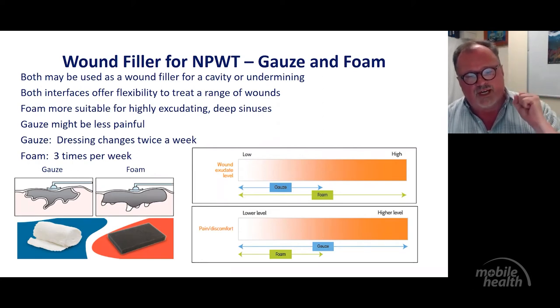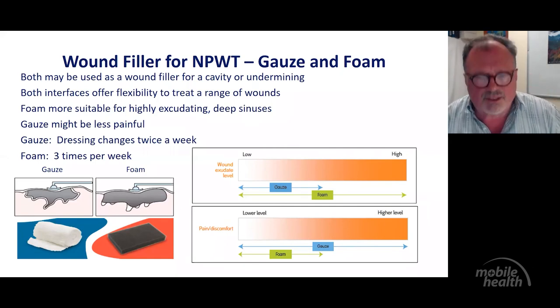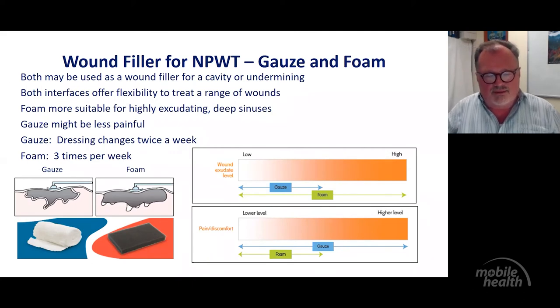The cotton fibers of the gauze, when you squeeze them or put them under pressure, become very tight. So the fluid has to go through the tight cotton fibers and it takes ages to get through. And sometimes if it's too dry and too tenacious, it will not make it. Then when you do the dressing change, you can see that the wound has not progressed to the level of what you would have hoped.